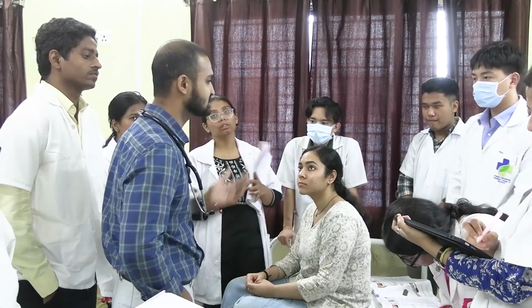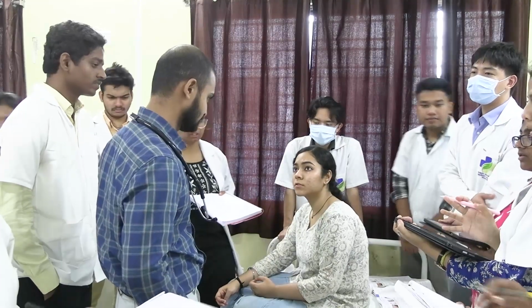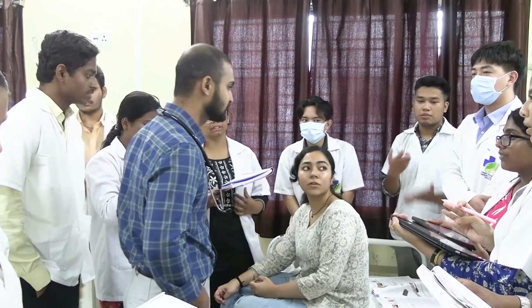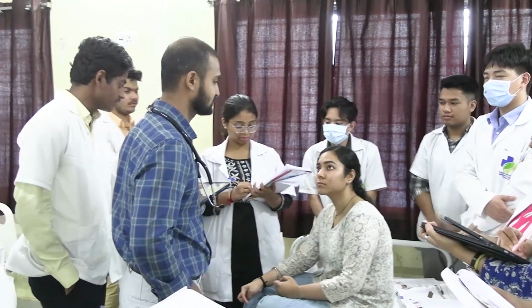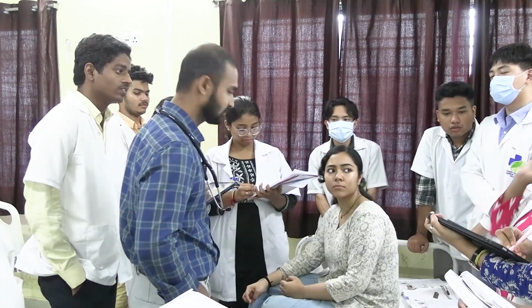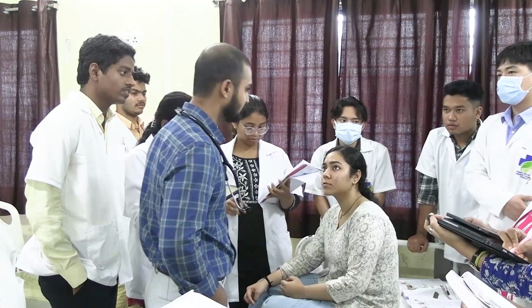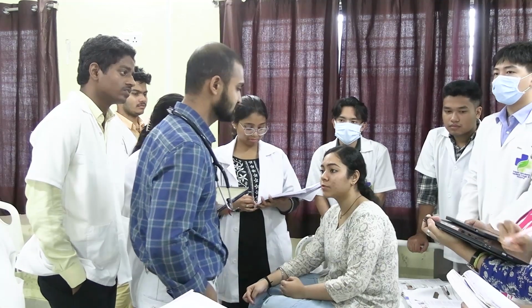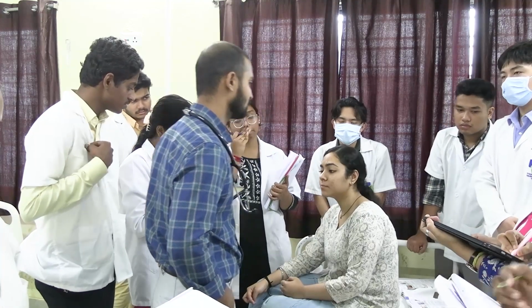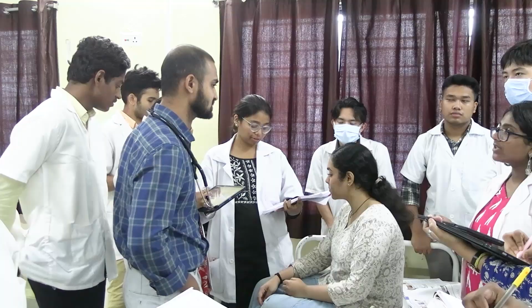So can you revise it? The first phase is 10 to 14 mmHg. How is the sound? Faint, clear, and tapping sound. Then the second is 15 to 20 mmHg. The third is loud and clear, which is 5 to 7 mmHg. The fourth phase is muffled or dull. This is 5 to 6 mmHg.